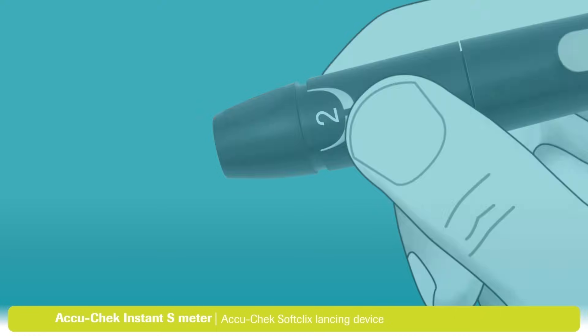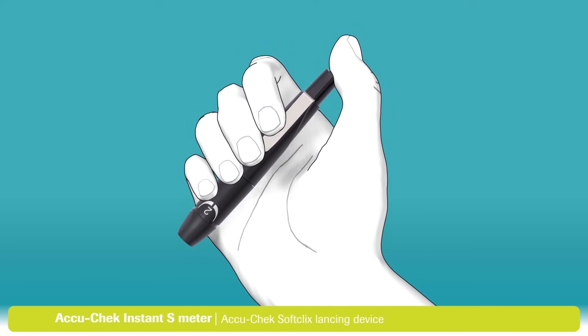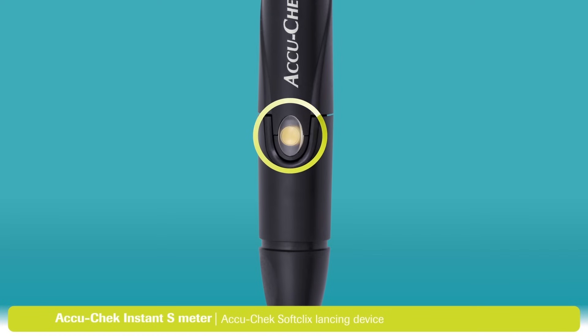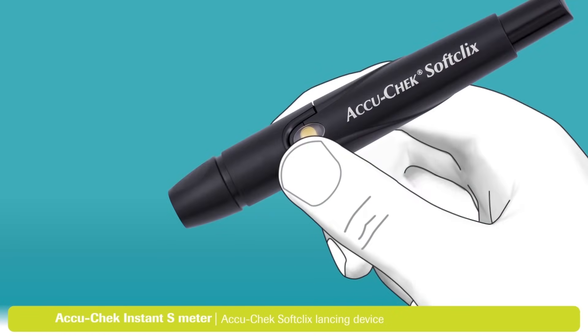To use the lancing device, you first need to prime it. Press the priming button all the way down. The release button on the side of the lancing device will turn yellow — this indicates that your lancing device is now primed and ready to use. Press the yellow button to release the lancet and lance your finger.